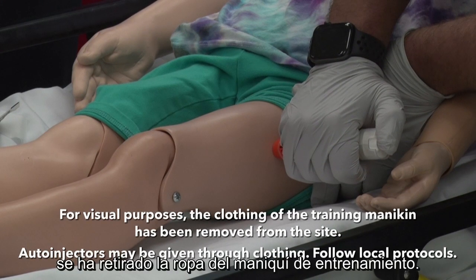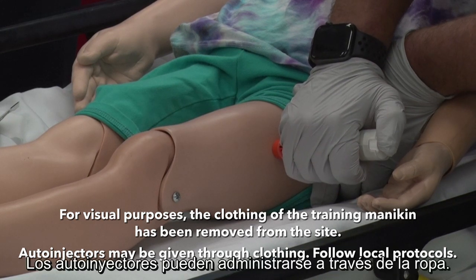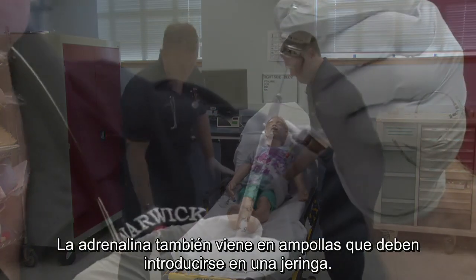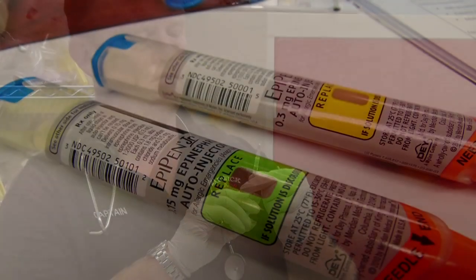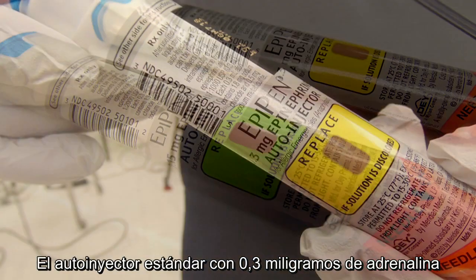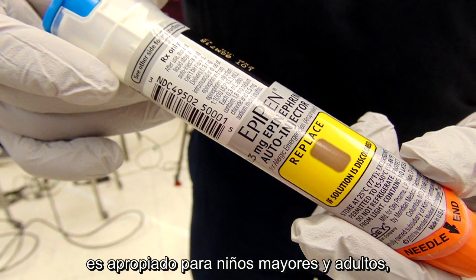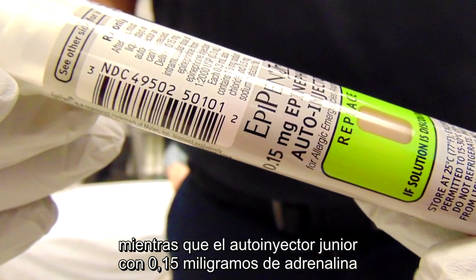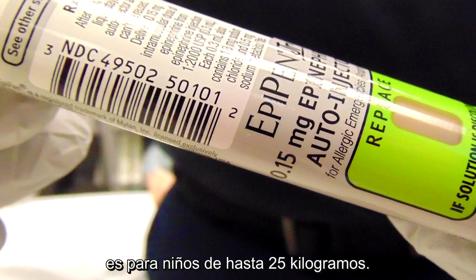For visual purposes, the clothing of the training mannequin has been removed from the site. Auto-injectors may be given through clothing — follow local protocols. Epinephrine is also available in a vial that must be drawn into a syringe. Single-dose epinephrine is available in two sizes: the regular auto-injector with 0.3 mg of epinephrine is appropriate for older children and adults, while the junior auto-injector with 0.15 mg of epinephrine is for children up to 25 kg.